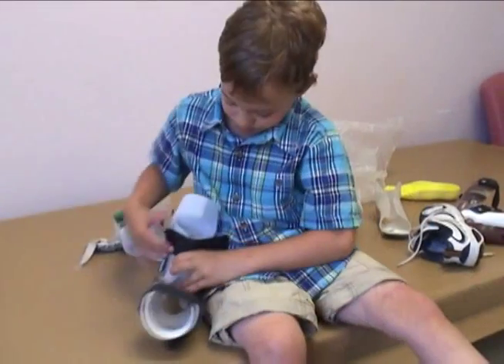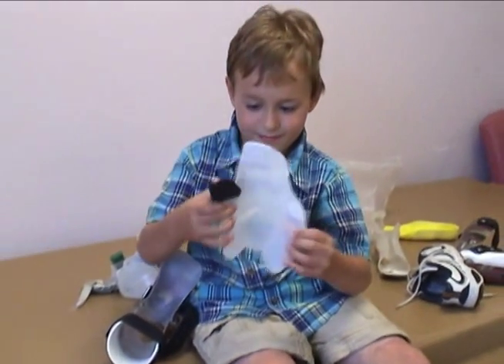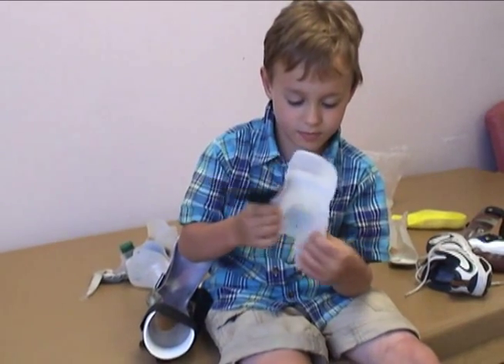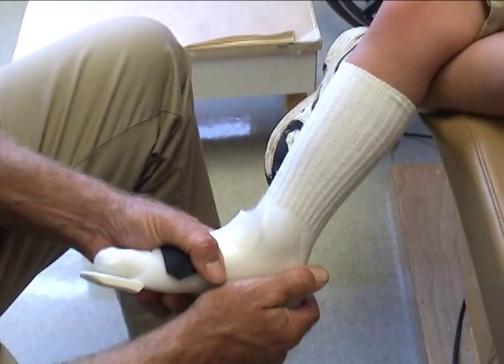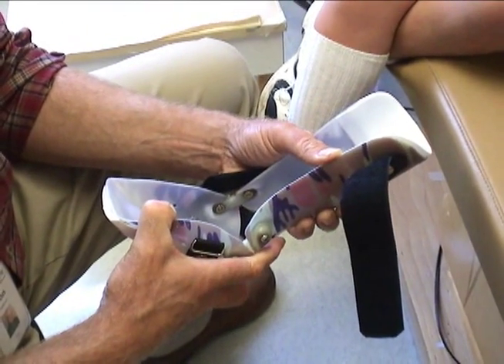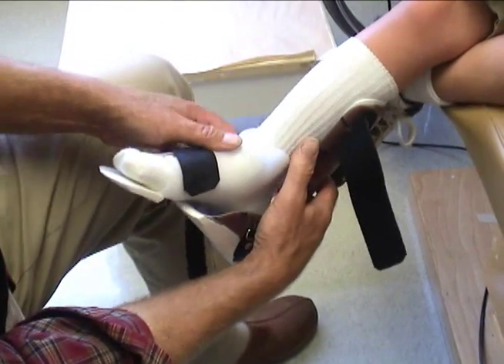We wanted to optimize the daily wearing experience for Austin, and our feeling is that the polyethylene liner represents the least bulky option, which still allows us to give precise and flexible control of the foot within the more rigid and structured framework required for the tamarack hinges of this design.